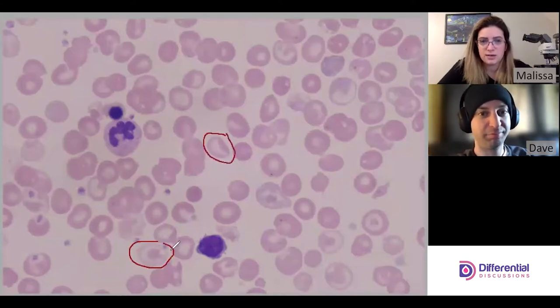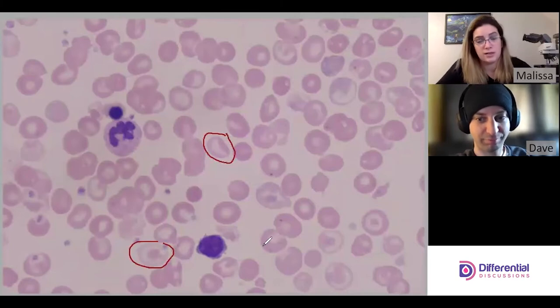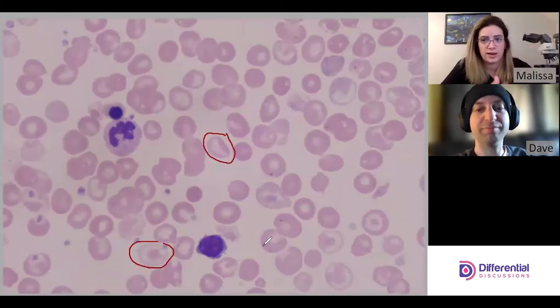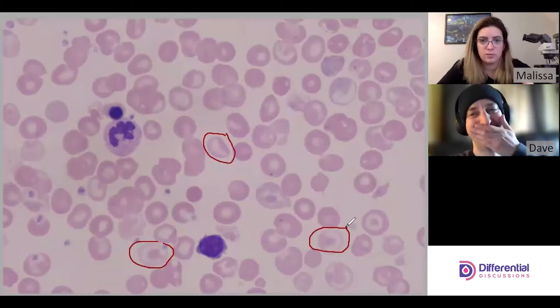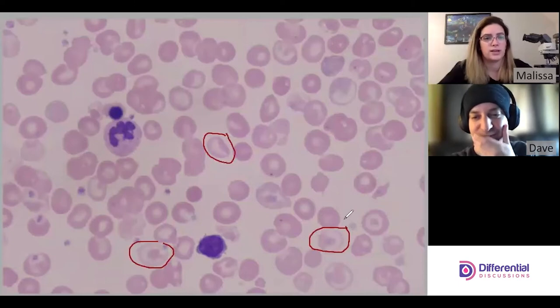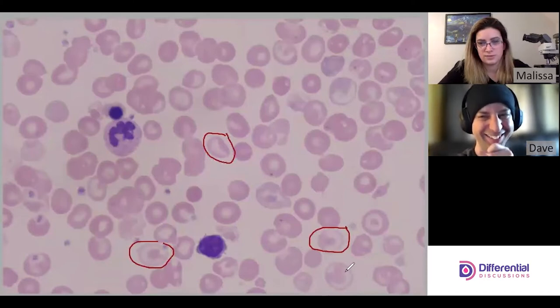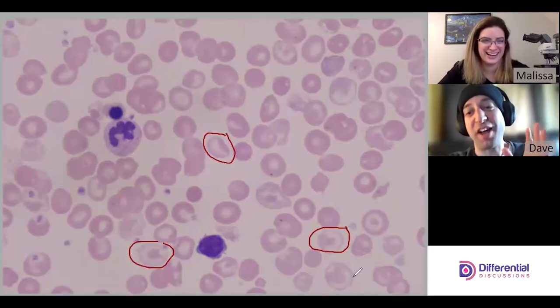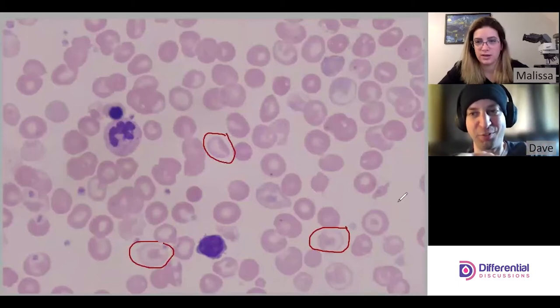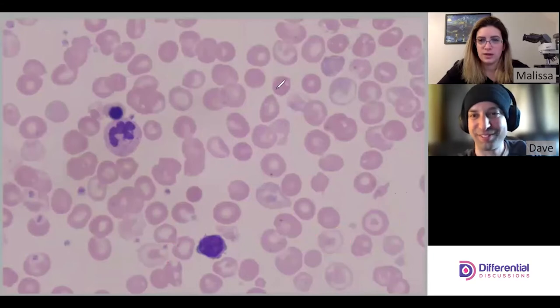Some codocytes you can clearly see as classic targets, and then some are kind of squashed in the area you're finding them — an incomplete one where it's not a complete circle. There are lots of different cells here that are true codocytes that just don't have that perfect target appearance. And there's an absolutely gorgeous textbook codocyte right there — that one is perfect.